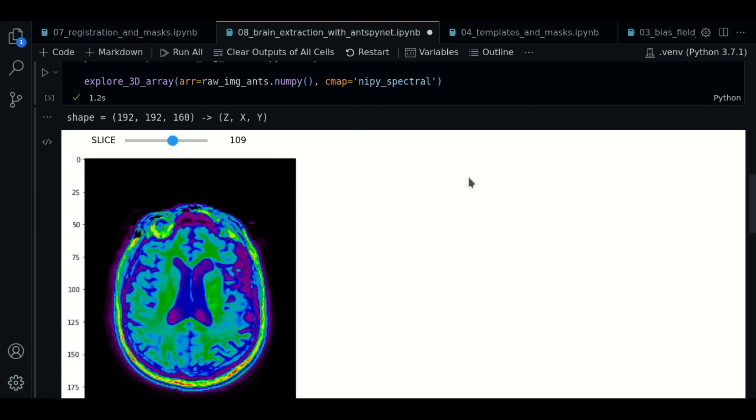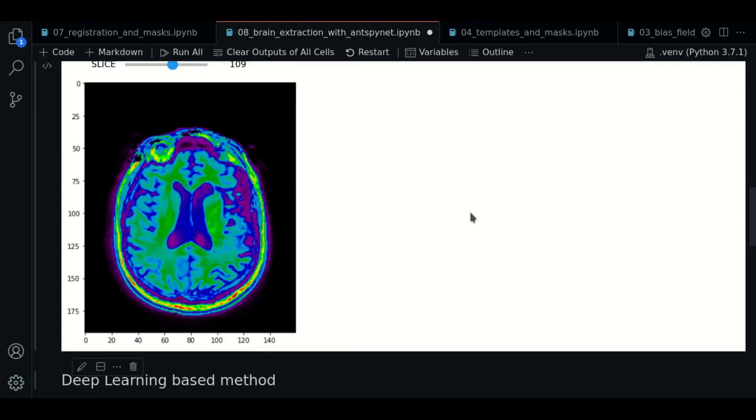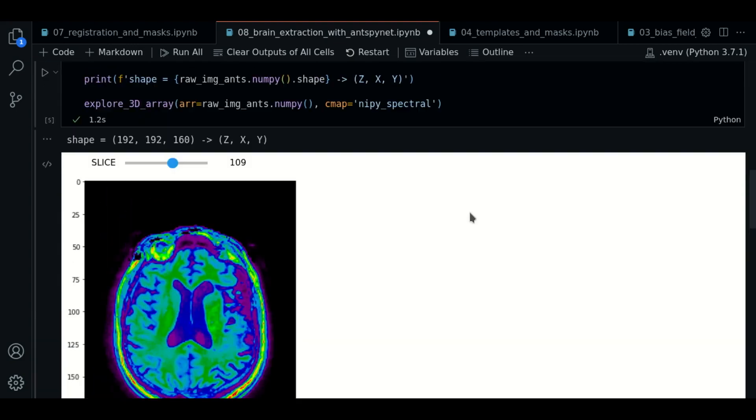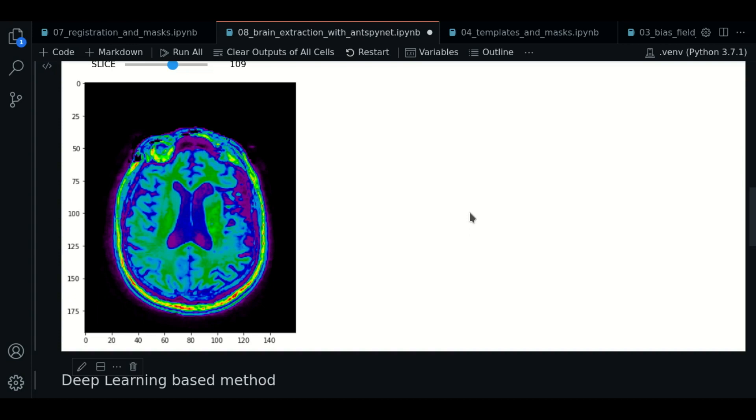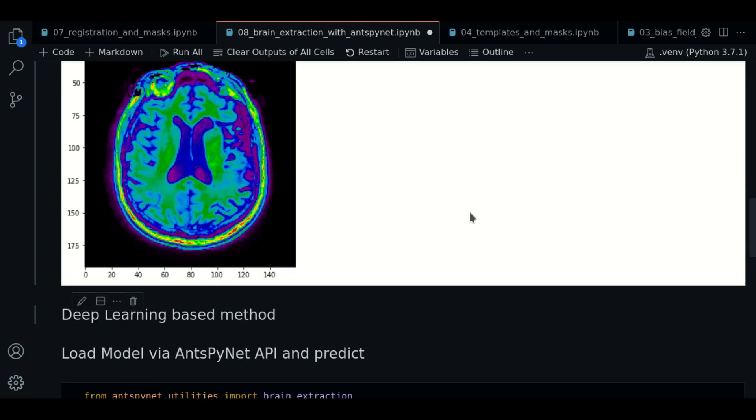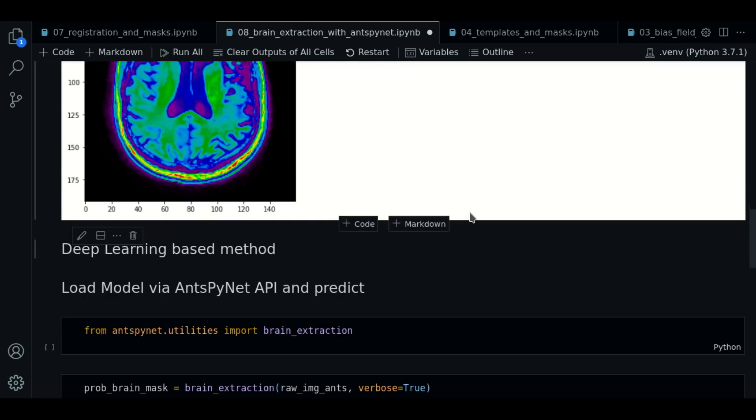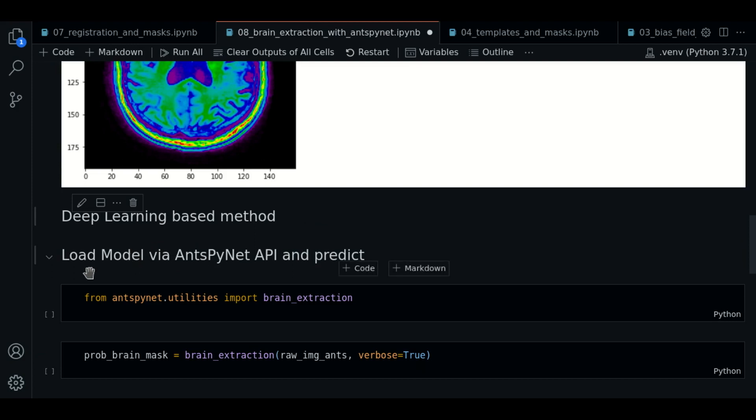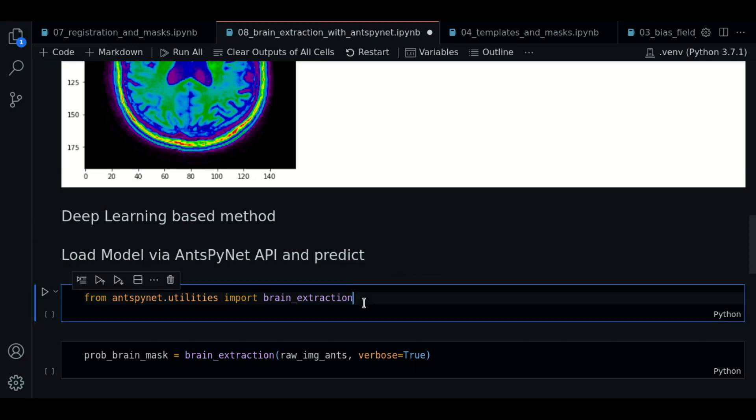We will start with the convolutional neural network method. The implementation we will use is inside the library ANTSPY.NET. This is an extension of the ANTSPY library that contains multiple pre-trained models for this purpose. So, the first thing we are going to do is to import the brain extraction function.